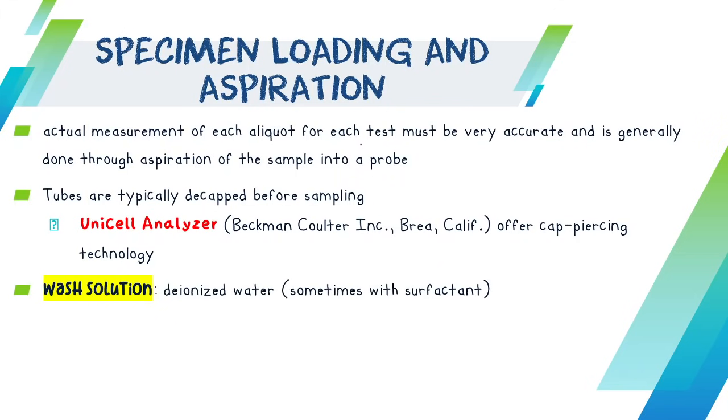Now, the commonly used wash solution, or actually ang wash solution gyud na ginagamit is your deionized water, and sometimes it is with a surfactant. Wash solution is important and dapat dili ni siya mabutangan og other pa na mga reagent kay since this is necessary, labi na kay di ba probes bya na ang naa, and ang mga probes bya ninyo dili man ni siya na taga isa ka sample na isa ka specific na probe.